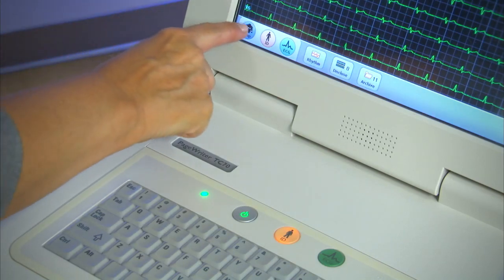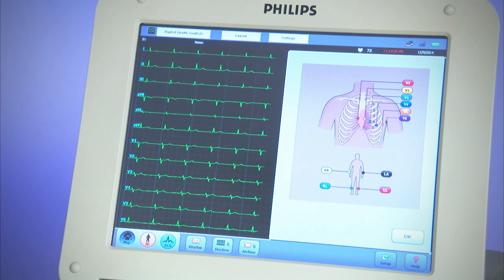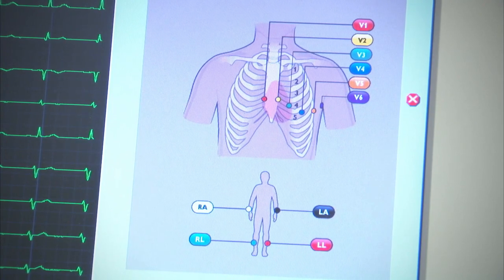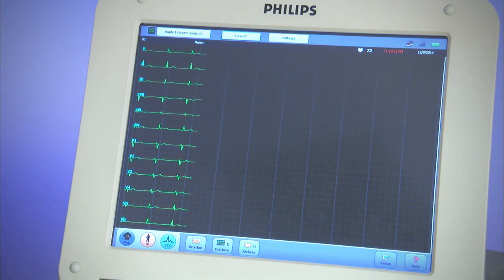Lead map is a guide for correct lead placement. Step 1 is to touch the blue map icon in the lower left corner to display the lead placement locations. If a lead connection is bad, a red X will appear next to its lead label. If all leads are correctly placed and picking up strong signals, then the next step may be performed.